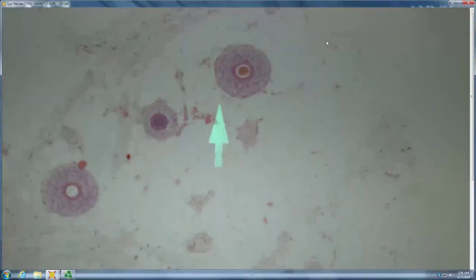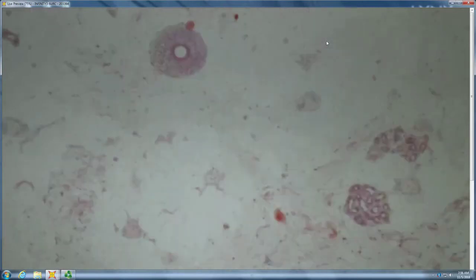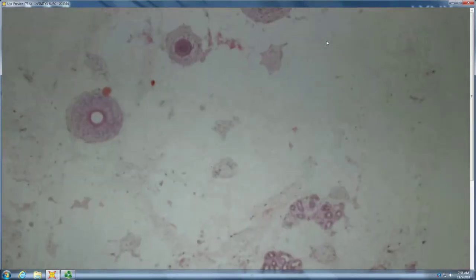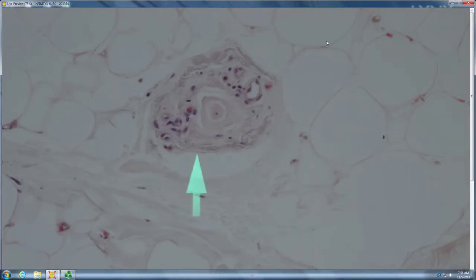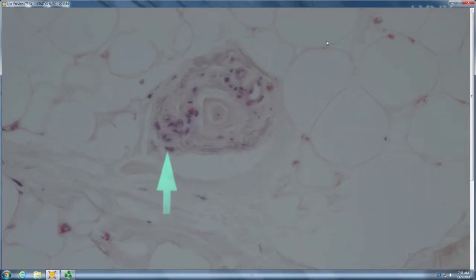So what else do you have going on? Are the hair shafts all the same size? No. And the follicles are not the same size. Yes, so you've got anisotrichosis, and you've got lots of fibrous tract remnants. In those fibrous tract remnants, are they scarred, or do you have normal vascularity? Normal vascularity, and a normal elastic sheath around it. Do you see eos? Do you see lymphs? Do you see pigment? No. Nothing. They're just lots of normal fibrous tracts.